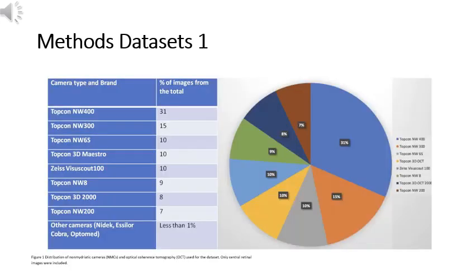Optretina has been carrying out a telemedicine screening program since 2013 in optical centers and since 2017 in workplace offices and private companies. This study is based on the tagged dataset from Optretina, composed of 306,302 retinal images, labeled with diagnosis, laterality, and quality. Ophthalmologists, all of whom are retinal specialists, have evaluated all of these images.